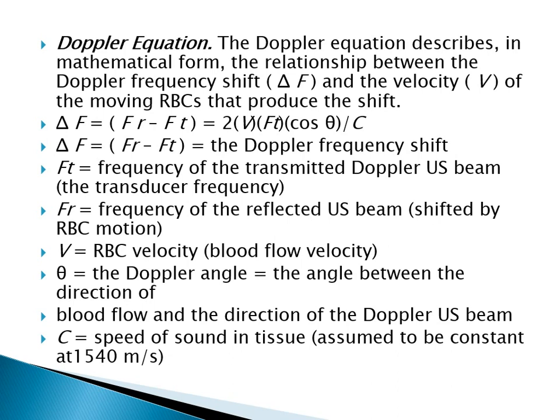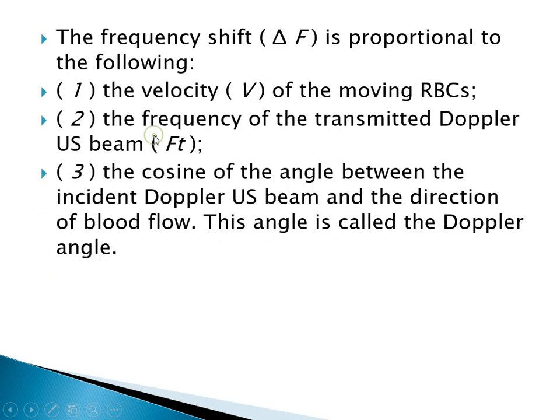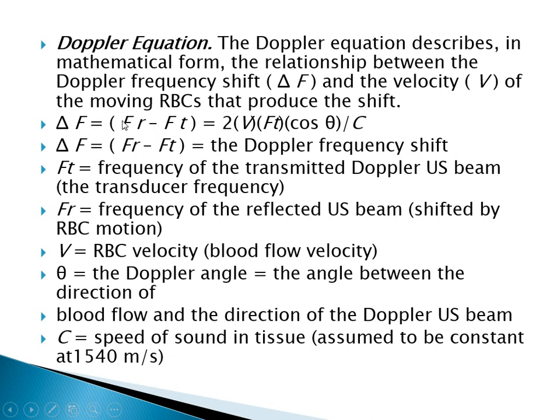We have the Doppler equation to understand the Doppler shift frequency. The Doppler shift frequency is equal to the frequency of the sound reflected minus the frequency transmitted.